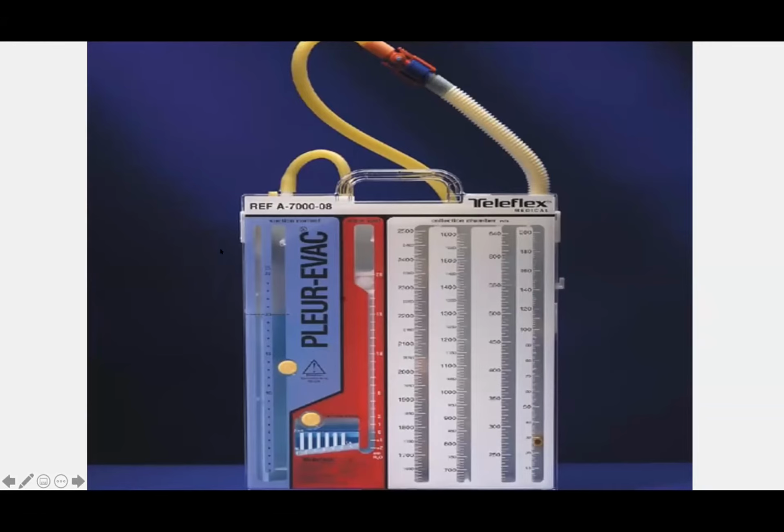So we're coming to our regular pleurovac we are using, or the 3-chamber system. Basically you have here the underwater seal. To start with, whenever you are preparing your patient to have a chest tube for drainage, you have to make sure that everything is functioning well. So simply you will start by adding water here till the level of 2 centimeters, which will correspond here to 0. This scale will help you later on for diagnosing if there is any leak.